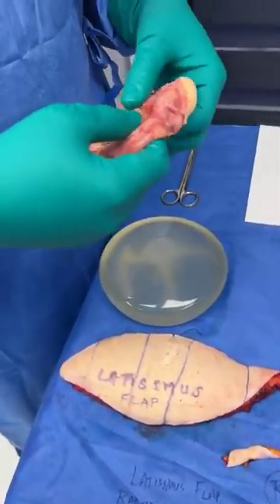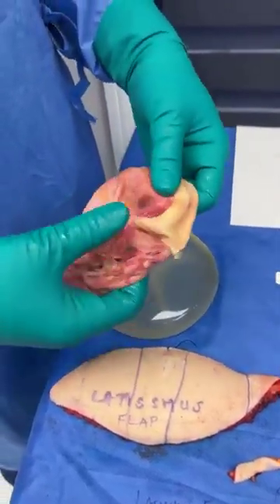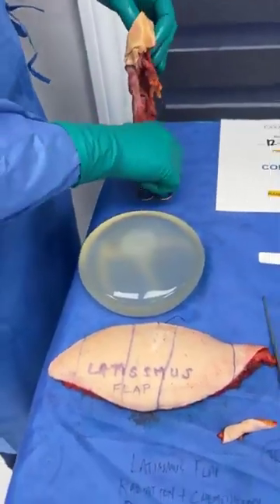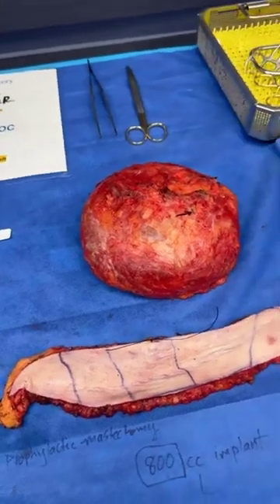Oh, the capsule was so thin I left it behind. No, you cannot say that. You have to physically remove it and remove all foreign body, Ethibond, AlloDerm. So what I'm going to do now is I'm going to go ahead and put these.